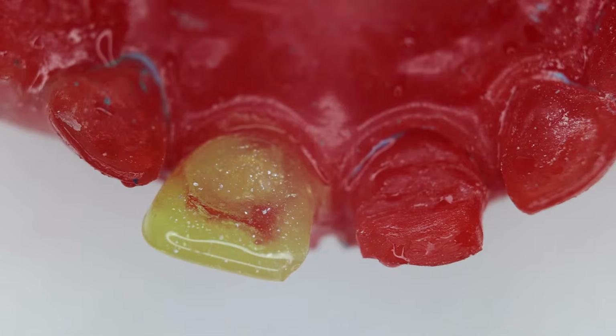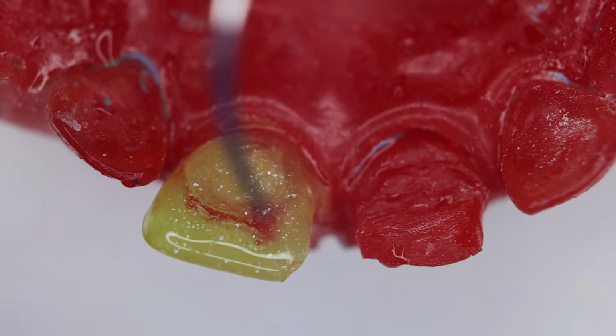Welcome back to the session again. This is a continuation session where we are continuing with the strip crowns. This is the crown that we did yesterday in the previous session, and today we are planning for the adjacent tooth, the primary central incisor.